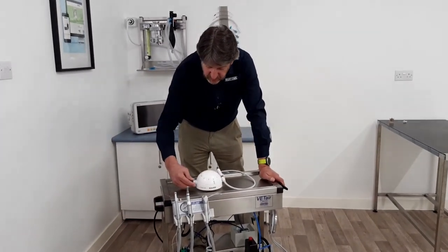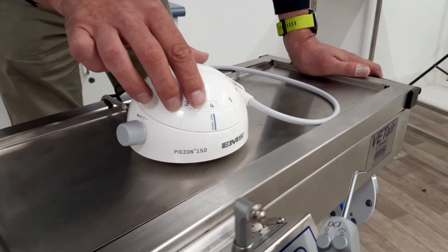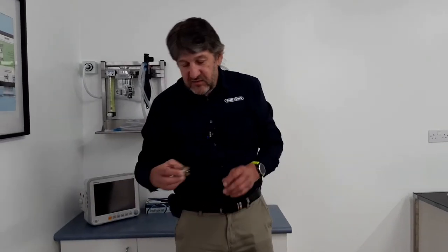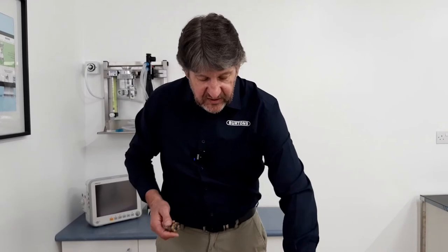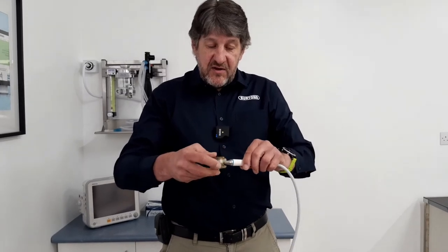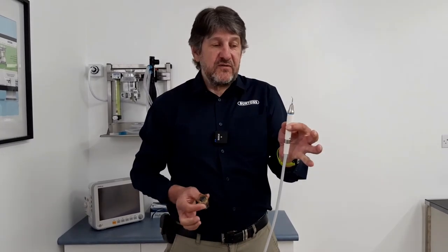This particular scaler has the water control unit on the side and the power supply on the top. It also comes supplied with a number of scaler tips already inserted in the torque wrench. They are simply screwed into place, and then remove the torque wrench.